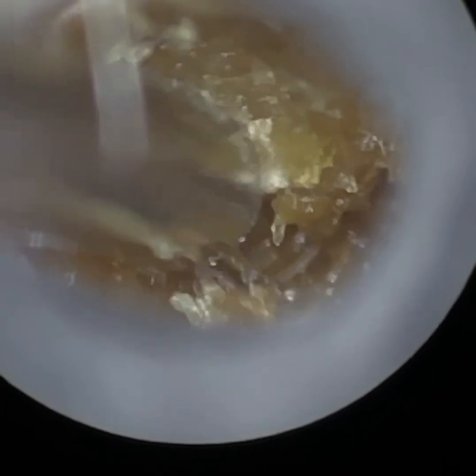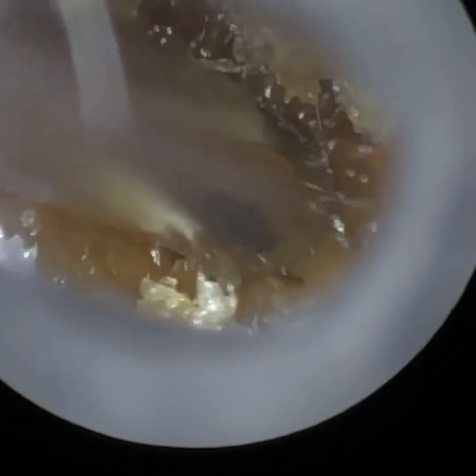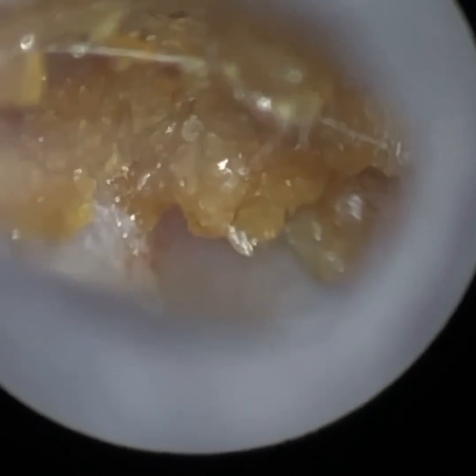For myself it's just become so natural now, and there was a bit of a learning curve, like with anything. So if you are able to use the iClearscope endoscope, for me there's nothing else that can compete against it in terms of full wax removal. What inspired me to develop the iClearscope was that I was originally trained removing earwax using loops.